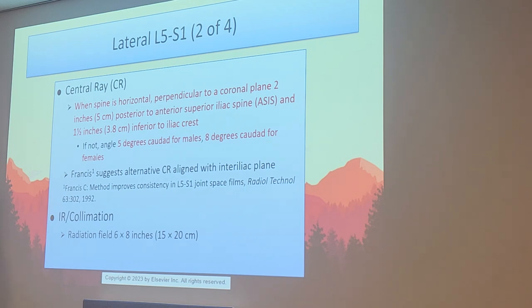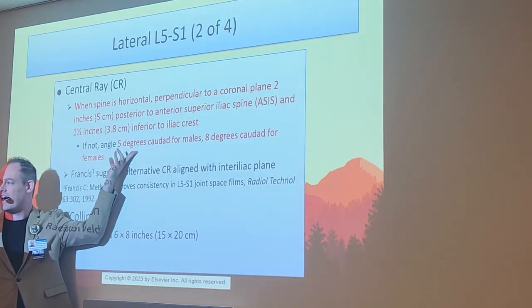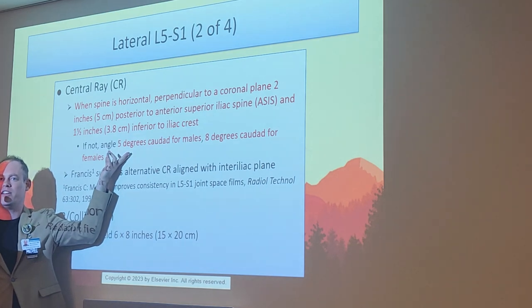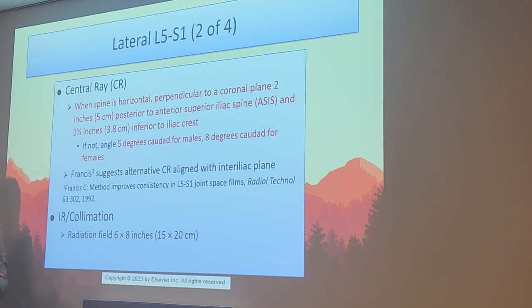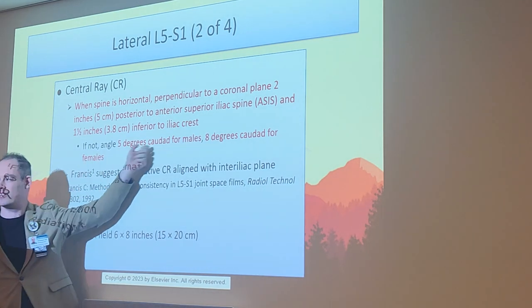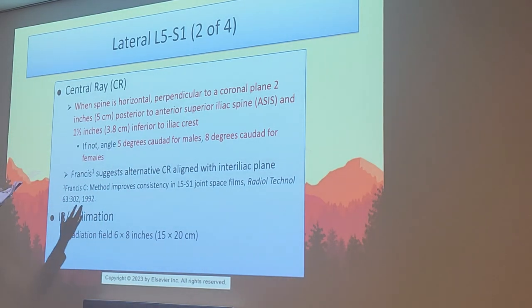Now, if not, in general, this is the general rule: you want to do about 5 degrees caudad for males, 8 degrees caudad for females. Females, you always do a little bit more because of the wider hips. But for me, my go-to number of 7 between the two works every time. It's been a perfect angulation for almost every patient, whether male or female.